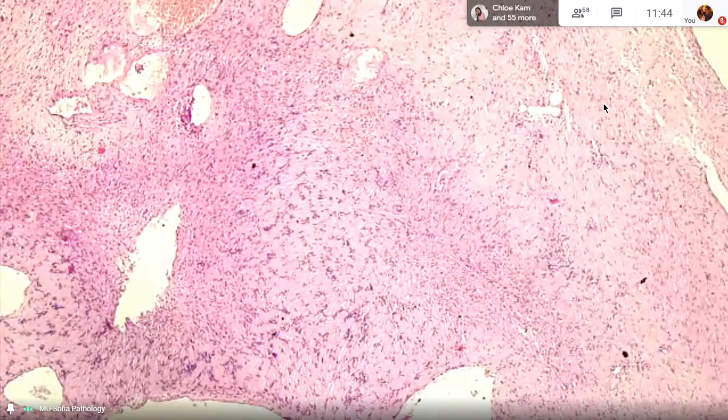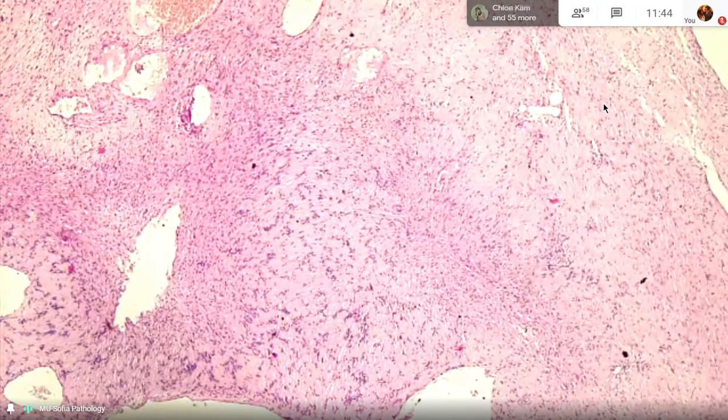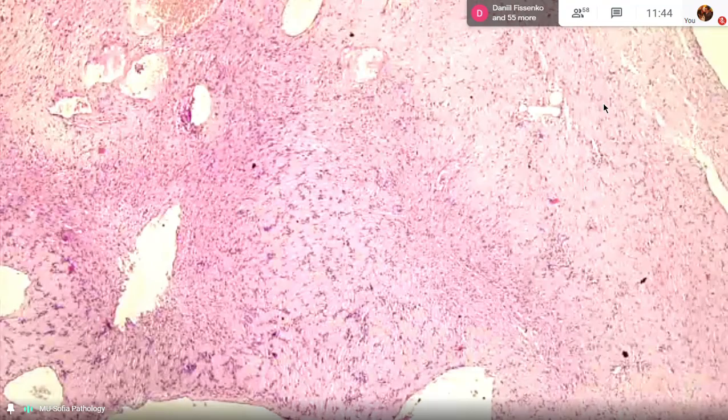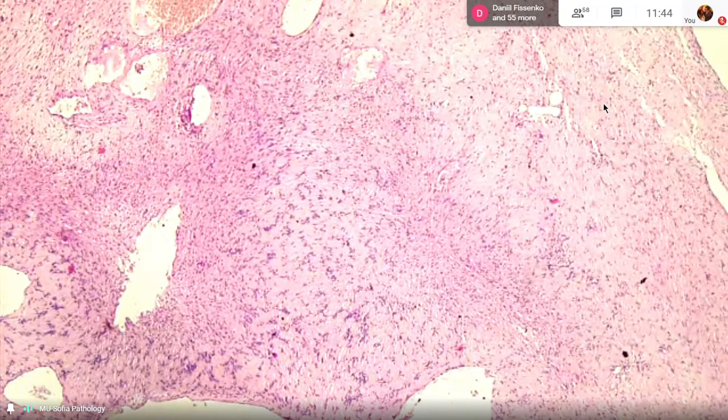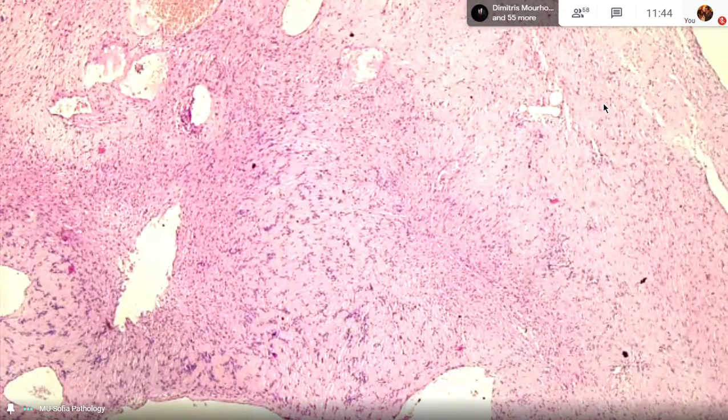Is it clear? What about if I have some doubt, for example, if I have just this fascicular pattern and it is not located in the 8th cranial nerve, I'll have a problem, I'll think of some other tumors probably. What type of immunohistochemistry do you recommend?